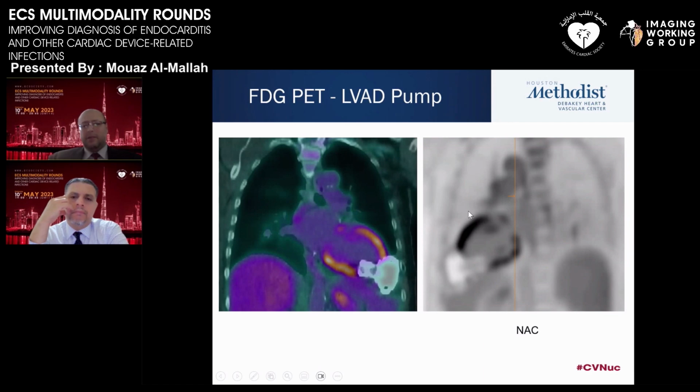we couldn't suppress the myocardium. So this has failed even after 12 hours of fasting. But since we are mostly looking for the non-device and the patient was sick, we can look around the device itself, but you can see at the point of junction, we cannot tell for sure.